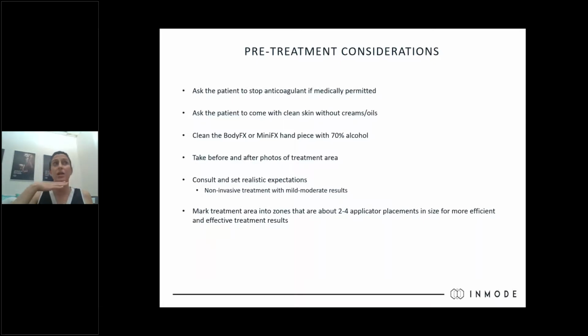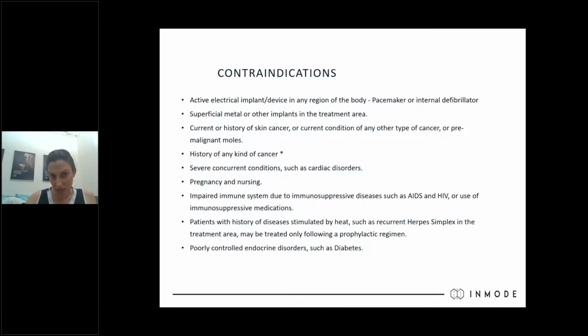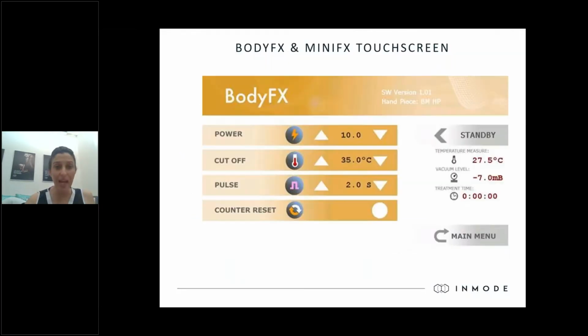The highest area that we're targeting is the submental area, submental fat here, not more than that, okay? The idea of the Mini FX is to be able to target smaller body areas, like this area, like the arms, like above the knees, stuff like that, okay? Not facial treatments. I stress that out. Okay. Yeah, as we said, read that, make sure that your patient's not suffering from any of them.